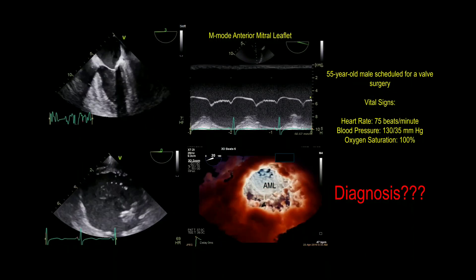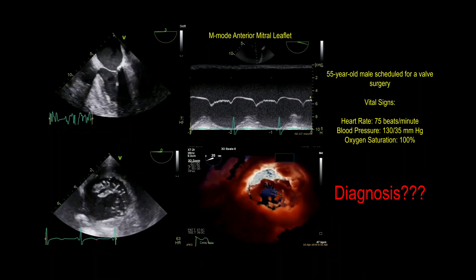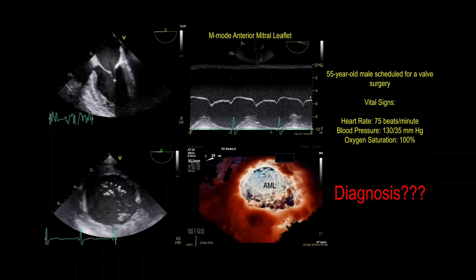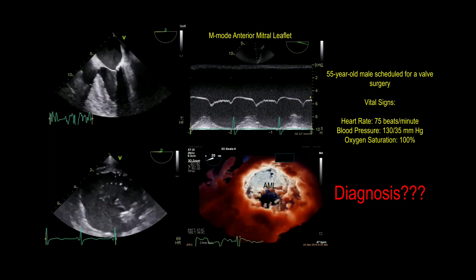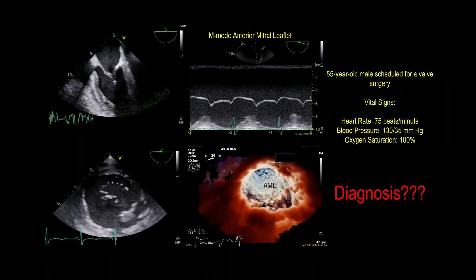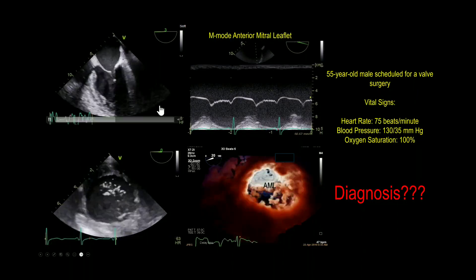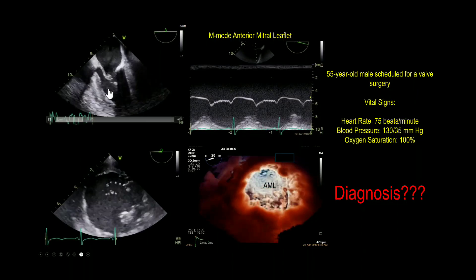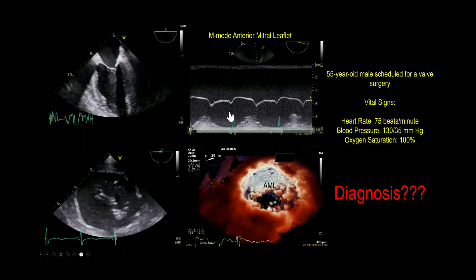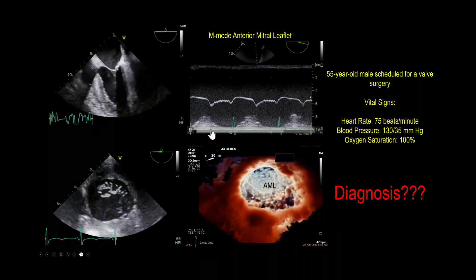We're not going to tell you which valve is the problem. The patient's heart rate is 75 beats per minute. Blood pressure is 130 over 35 mmHg and oxygen saturation is 100%. Going into the images — this is the mid-esophageal four-chamber view, and this is the M-mode through the tip of the anterior mitral leaflet.